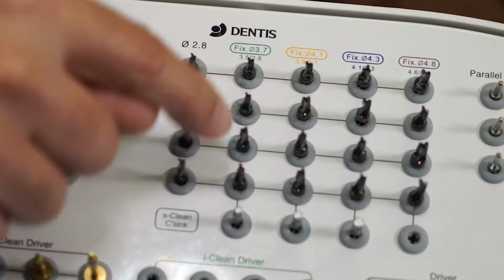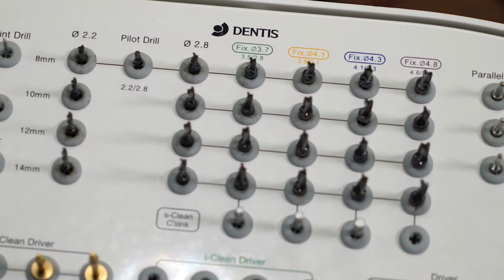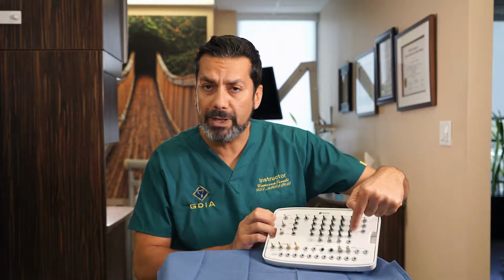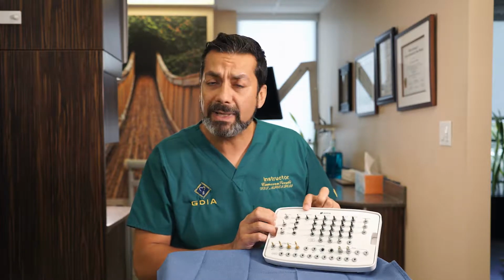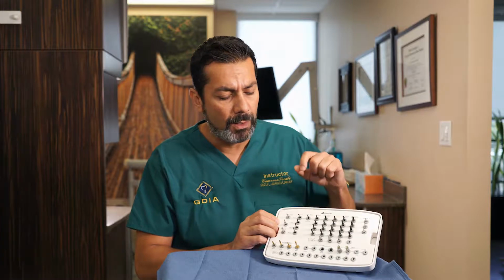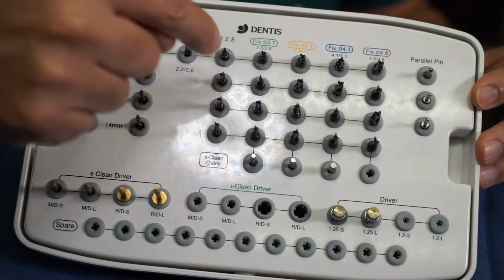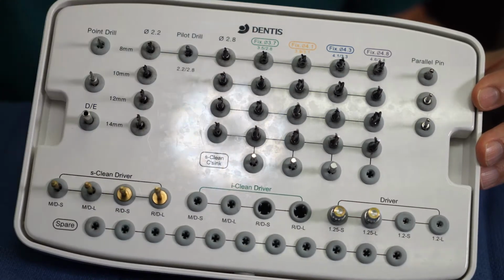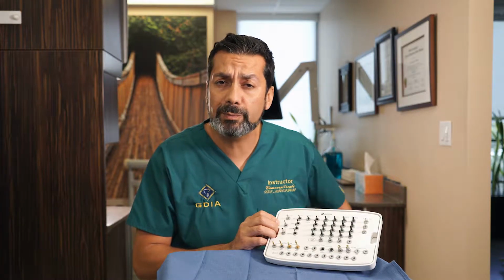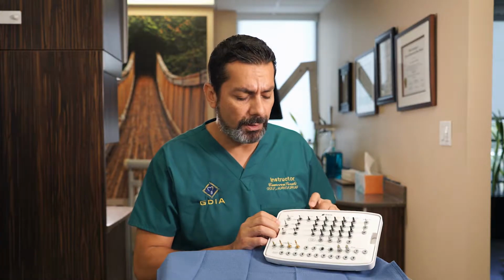So then you get to your 3.7, which also comes in the 4 lengths, the 8, 10, 12, and 14. Same with the 4.1, the 4.3, and the 4.8. So let's say you're planning on placing an implant that's a 4.3 by 10 millimeters. Well, you start with your 10 millimeter drill with 2.2, then you can go to your 2.8, 3.7, 4.1, and 4.3. You might want to stop early if you're in a soft bone like a D3 or D4 bone, and we'll discuss those protocols later on.